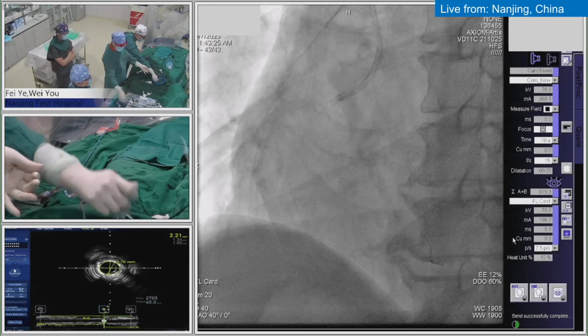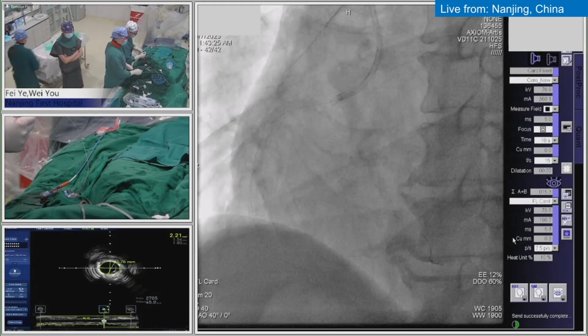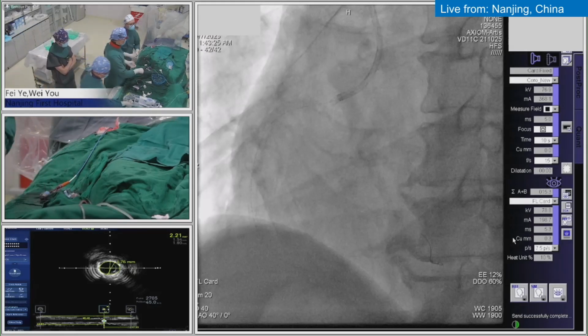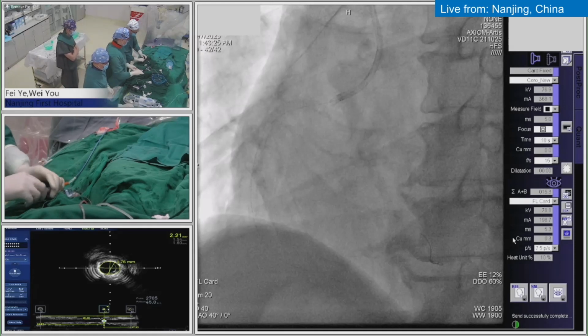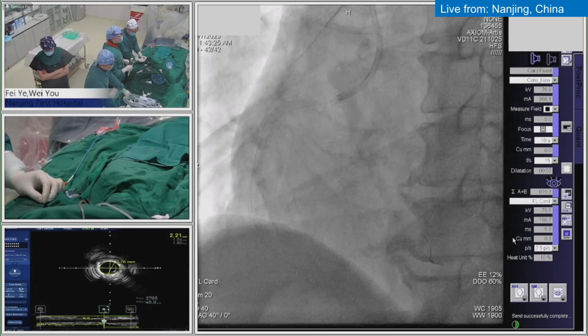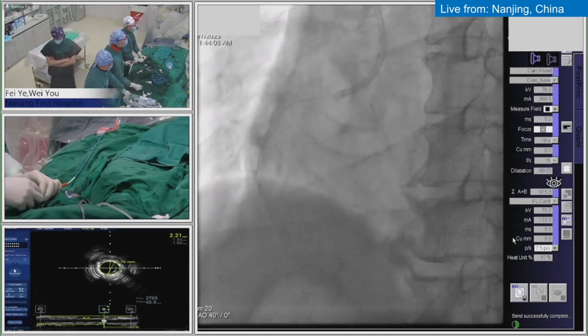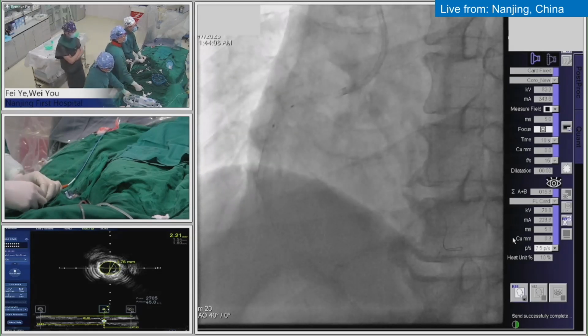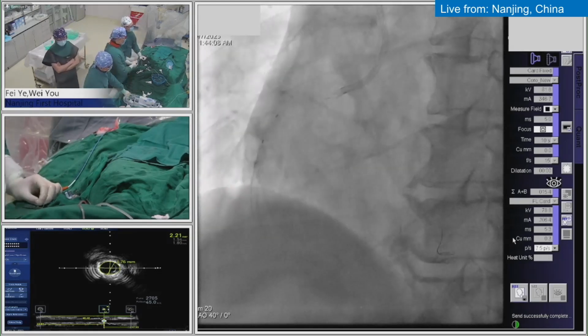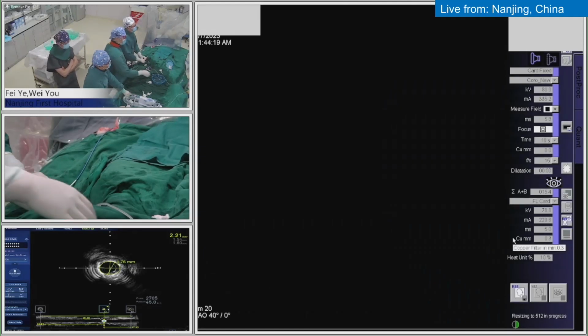If the NC balloon also fails, then from the IVUS, I would go according to the IVUS-derived calcium score of more than 2, and for a very big vessel where a big burr size is not suitable, I think IVL. Before the paper on the IVUS score for calcified lesions, there was little IVL data, so we don't know whether the IVUS score is suitable for IVL.